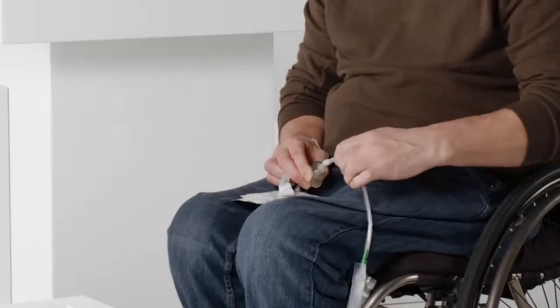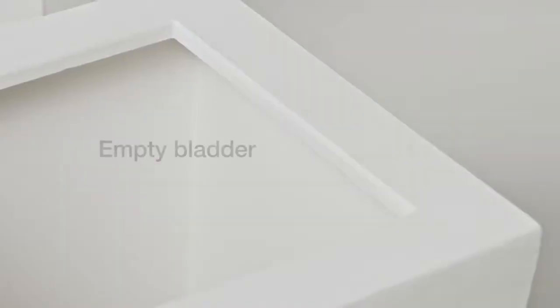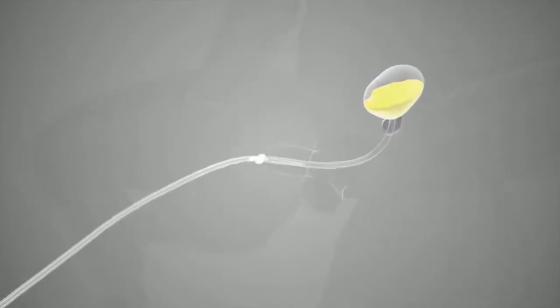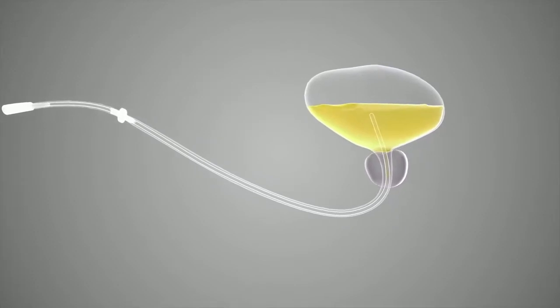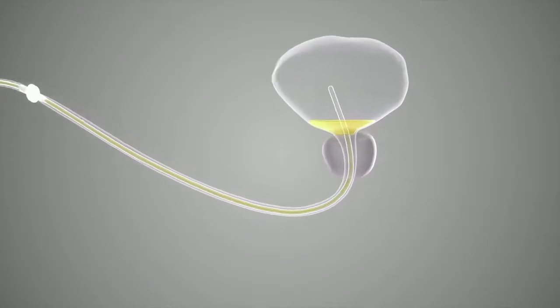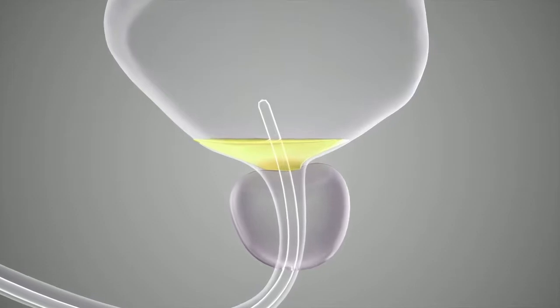Because I've got protection here on the catheter itself, it allows me to easily work my hand and work the catheter so that I can insert it to a point where it reaches my bladder. Insert the catheter forward until urine starts to flow. As soon as I start to see that it's started to finish draining, I pull the catheter slowly. I make sure that I'm getting all the residual in my bladder.